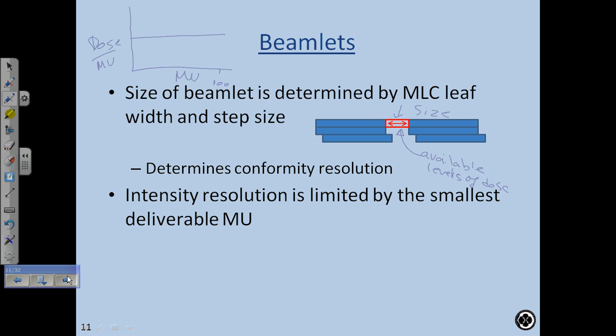That's fine, and this is straight here, but once you take some measurements, what happens out here, once you start hitting 2 MU, of course you can't do half an MU, so 2 MU and 1 MU, you'll start seeing that these values are higher. For 2 MU you might get a value up here, and then for 1 MU you're going to get a value up here. So that's nonlinear, and you don't want to be in this area.